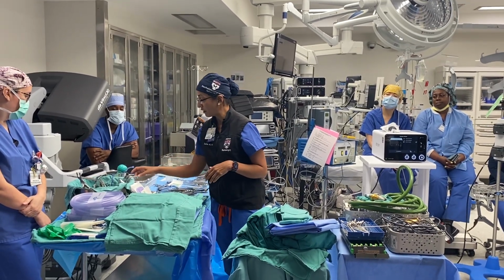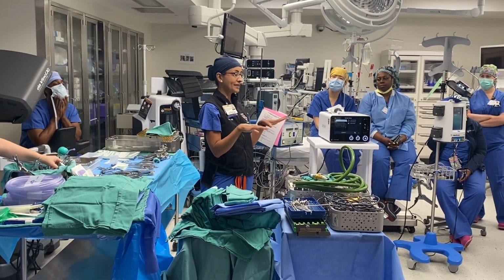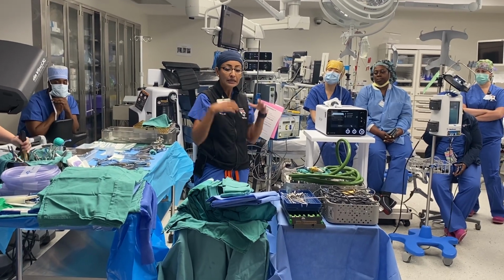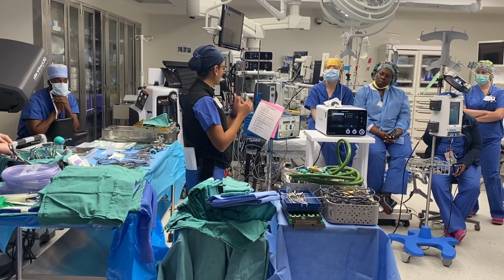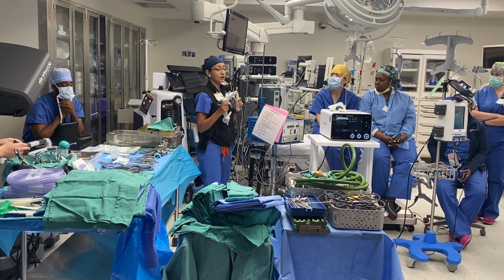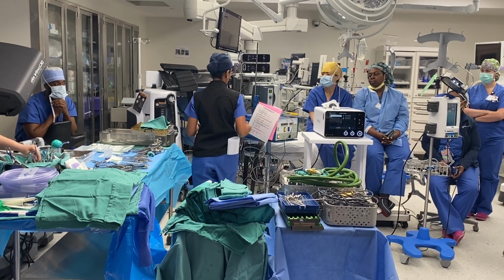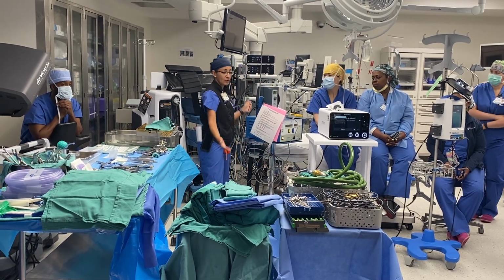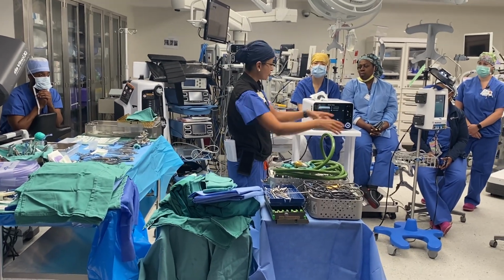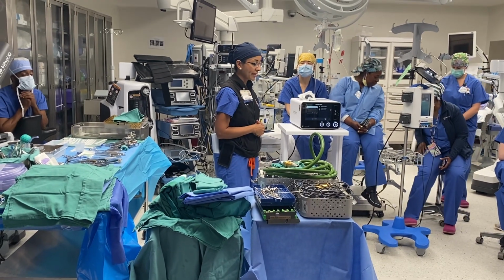And then just real quick, when we're at the back of the head, it's a little bit different. Same conceptually, right? We need to get pressure off that brain, but in this case, we're prone. So again, we always use the Mayfield, and you'll see us put this on while the patient is still supine on the bed, clamp their head, and then we'll flip onto typically a regular OR bed with chest and hip bolsters, and then connect the head to the head of the bed there.